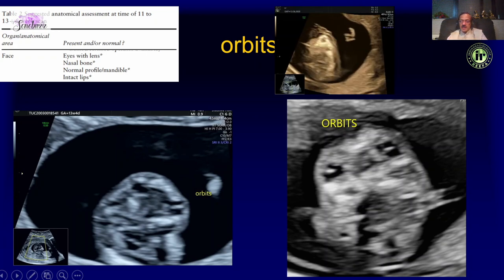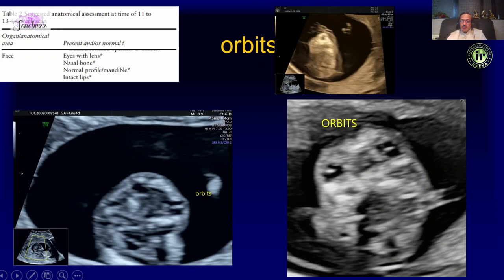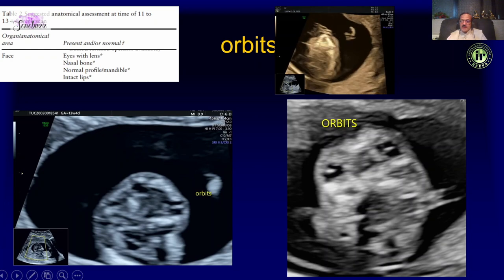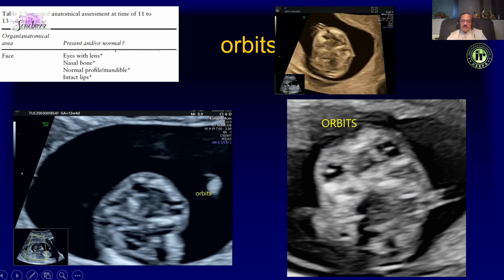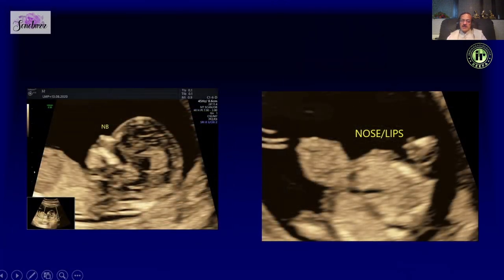Here is a 13-week fetus where you can see both the eyeballs as well as the lens in the first trimester scan. We can also look at the lips and try to get a nose-lip view, though this can be difficult and picking up cleft lips is very challenging at the NT scan.